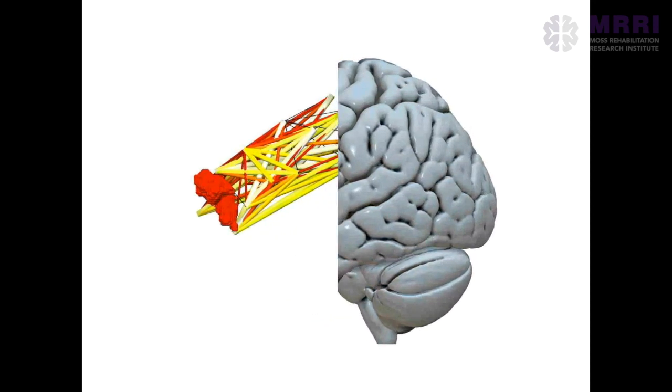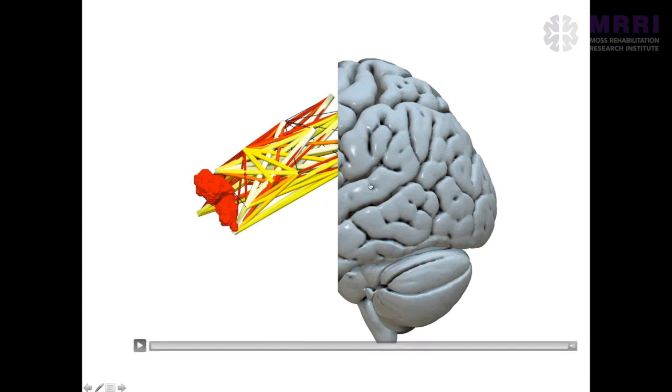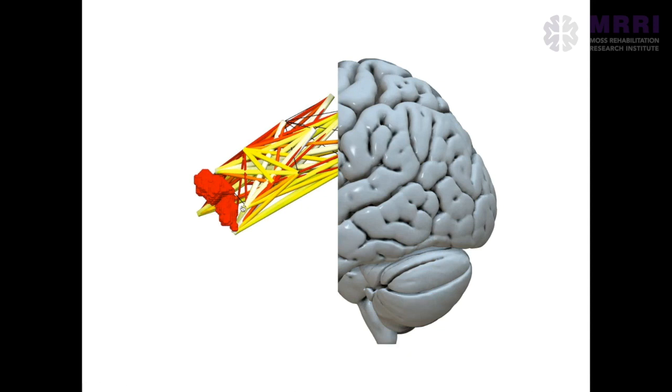So what we want to be able to do is to use this data set. Much like how we have lesions that are voxels that are lesioned or not, now we have a continuous measure of the degree to which two regions are disconnected, and we can enter that information into the SVR analysis, okay?